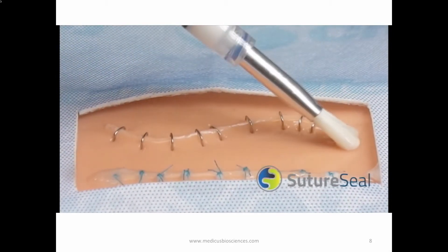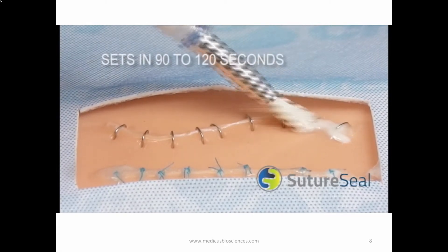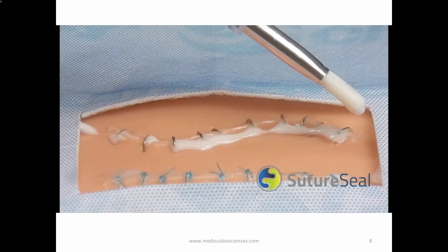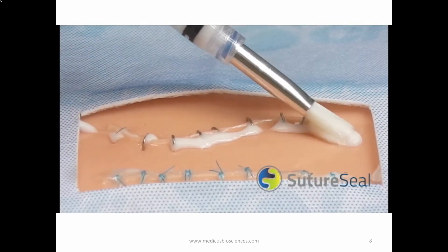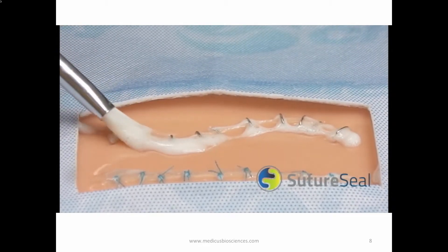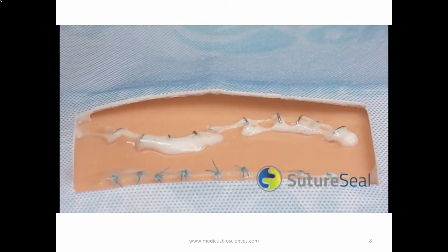Within two minutes, the SutureSeal polymer will become an adherent gel. SutureSeal will remain on the suture or wound area for 14 days and will biodegrade away slowly. Reapply a second application if the suture or wound is not completely healed after 14 days.